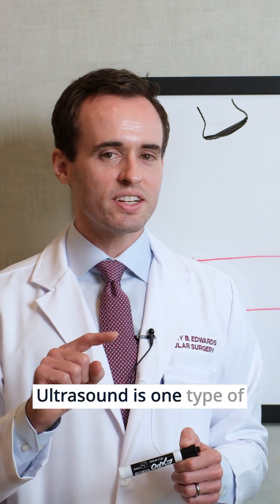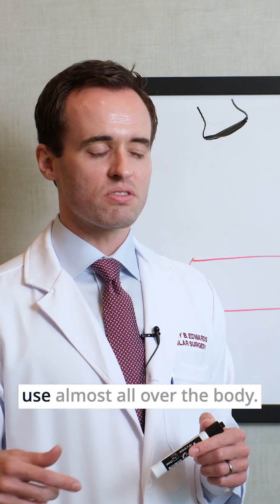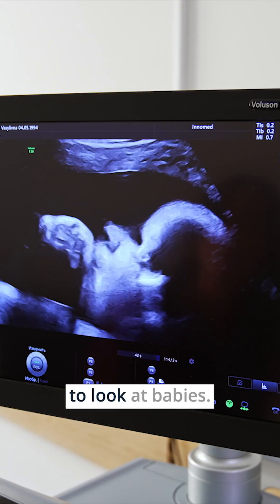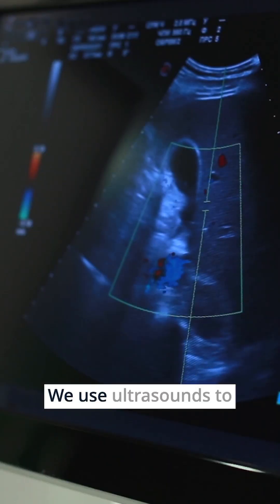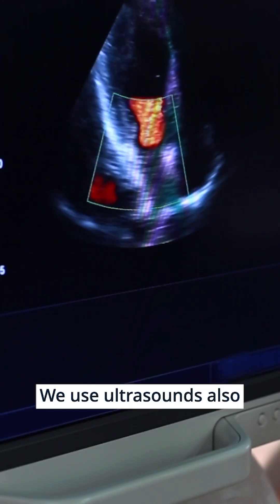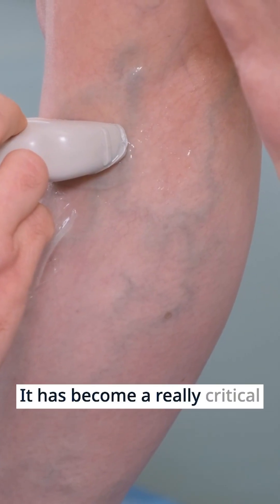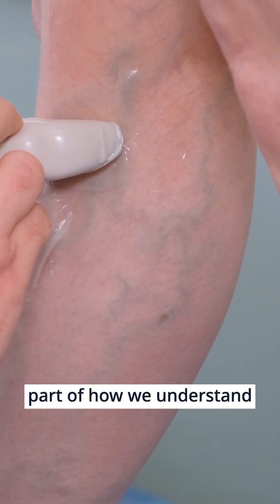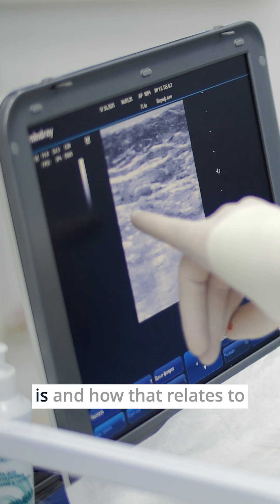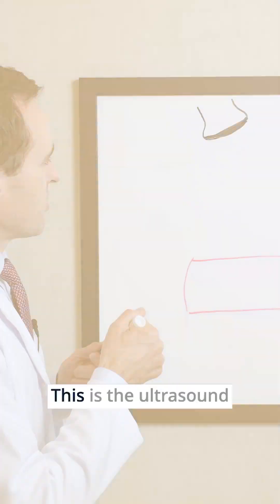Ultrasound is one type of vascular imaging that we use almost all over the body. We use ultrasounds to look at babies, to look at gallbladders, and also to look at blood vessels. It has become a really critical part of how we understand how your vessels are working, what your anatomy is, and how that relates to what your symptoms are.